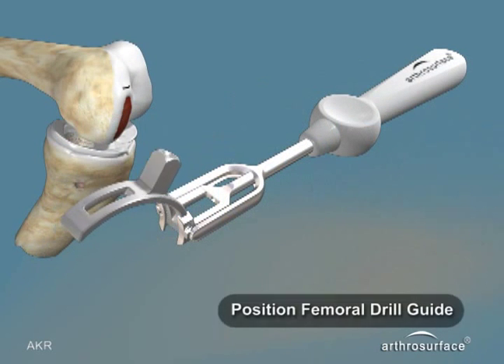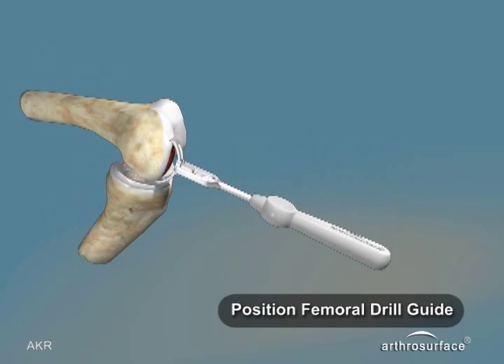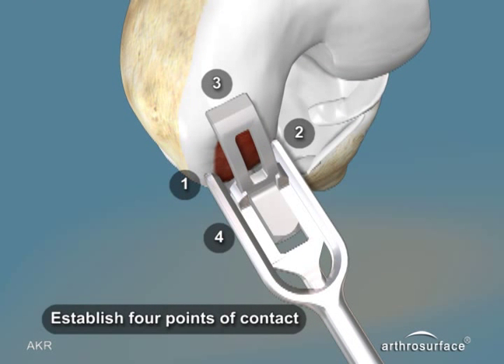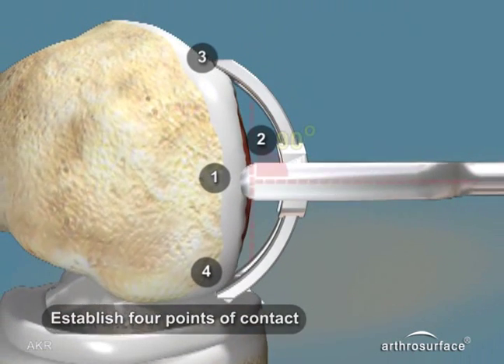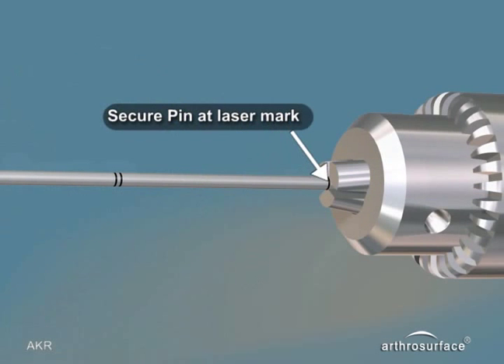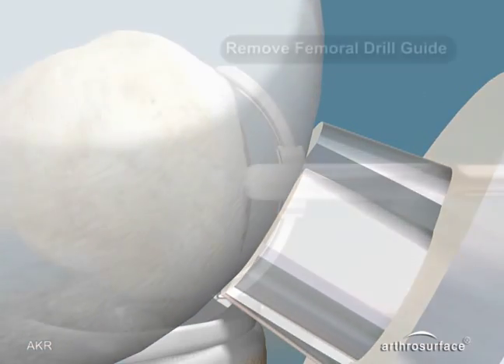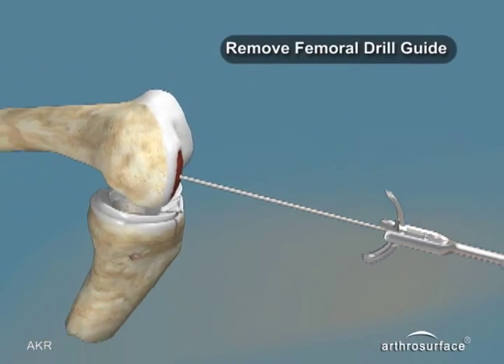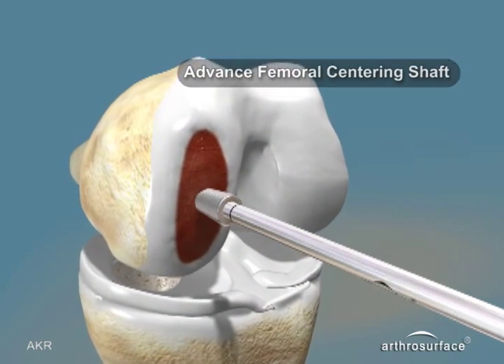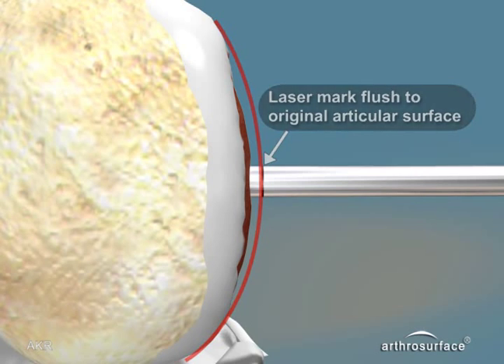Turning our attention to the femoral side, place the femoral drill guide on the distal femur. Pushing on the handle will deploy the stabilizing feet medial to lateral. Establish four points of contact to establish perpendicularity to the distal femur. Advance the femoral guide wire to the laser mark and remove the femoral drill guide, leaving the guide wire in place. Advance the femoral centering shaft over the guide wire to the depth where the laser mark line is at the height of the original articular surface of the femoral condyle.